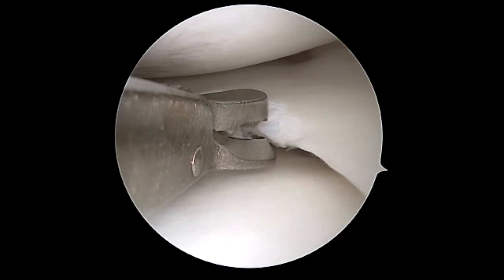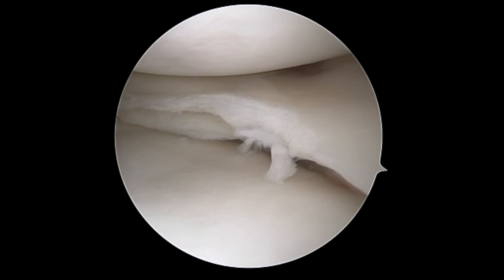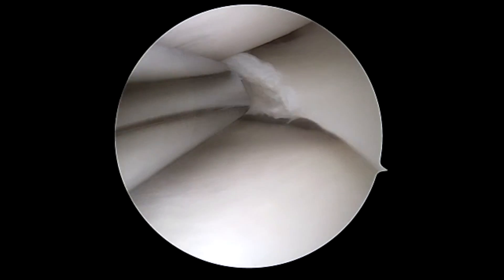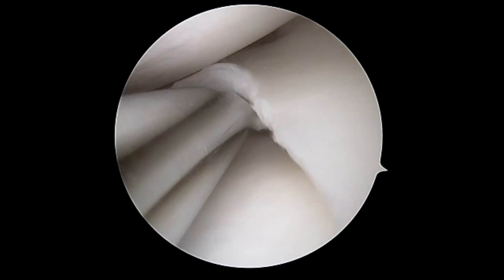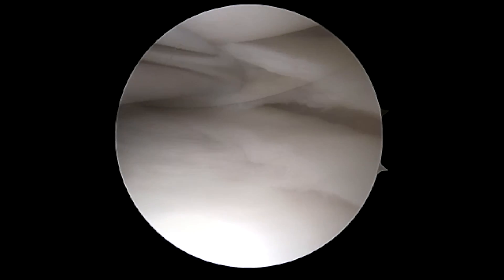We will taper off any of the remaining white-white junction so we have good access to the tear. We are further cleaning any loculations — you can see the extent of this horizontal meniscus tear. After completion of this with the shaver, ball rasp, and biter, we will prepare for fixation.